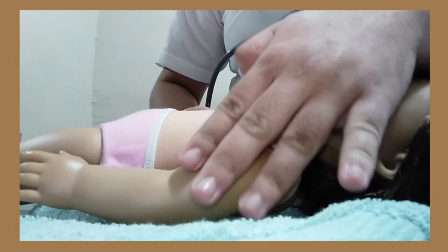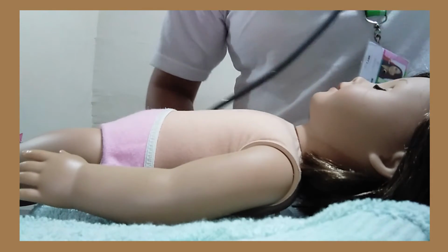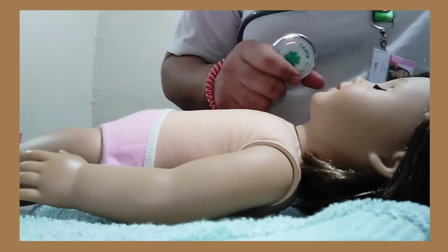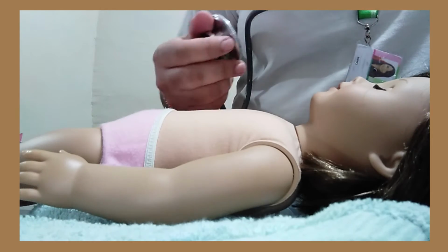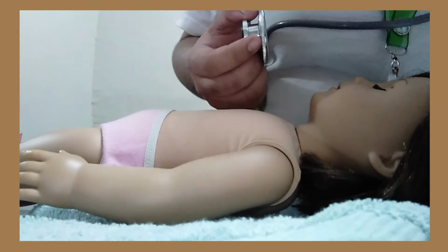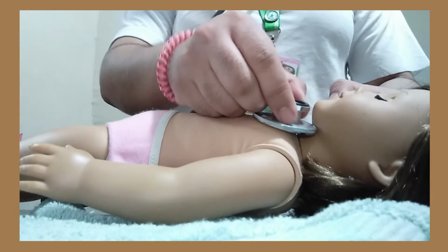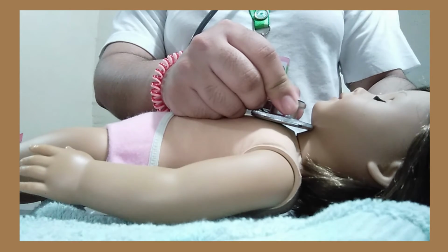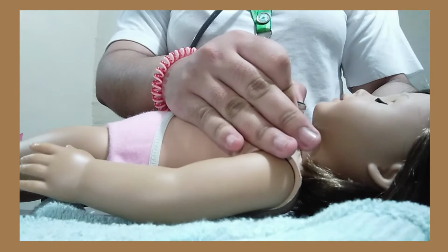Okay, very good. Now for the aortic stenosis, we're going to be placing the diaphragm over the carotids in full expiration. The aortic stenosis will be heard loudly in both carotid areas. Okay, ma'am, deep breath in. Deep breath out all the way and hold it.